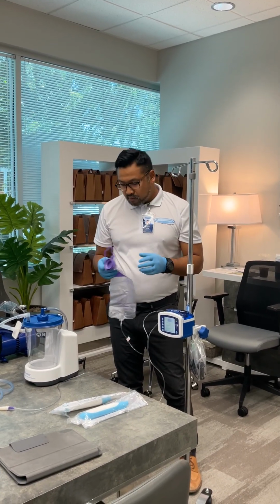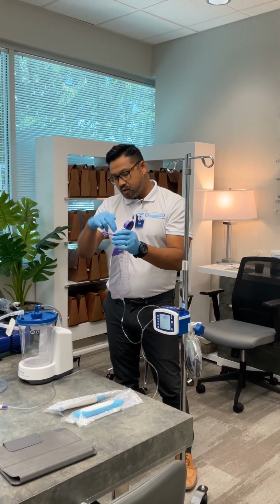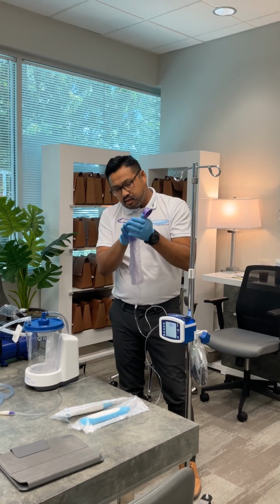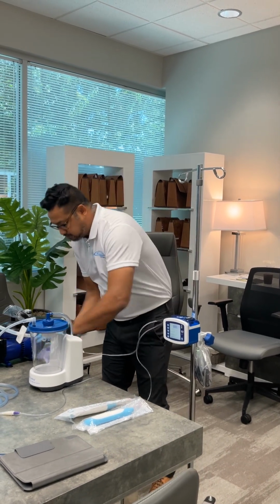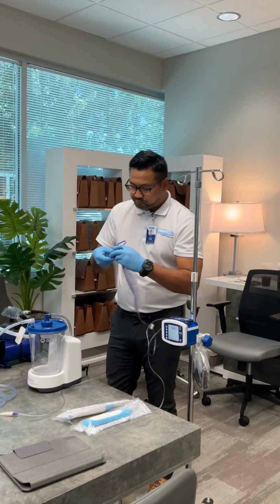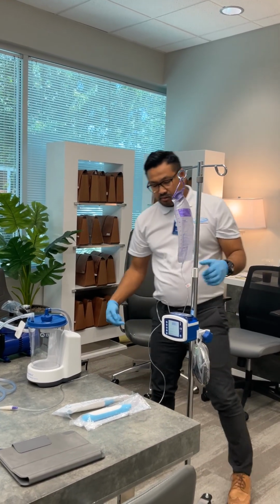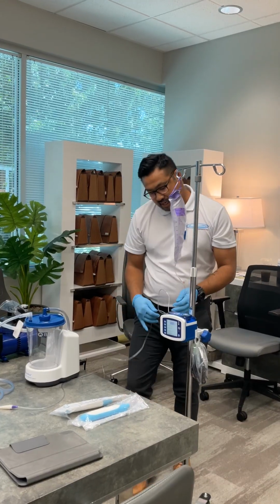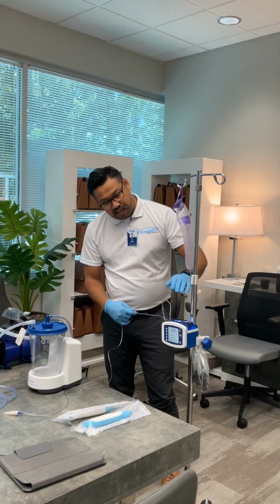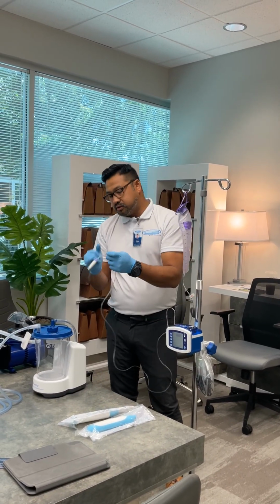So the important thing with this is that when you do add formula into this, you want to pour it in there. Of course, they're already pre-measured by the can. Then you want to squeeze out as much of the air as possible, like that, and then recap it and hang it. Along with getting as much air out as possible, you'll press the prime button, and what that does is run the black wheel there and get the formula all the way down the tube, as close to the end as possible.